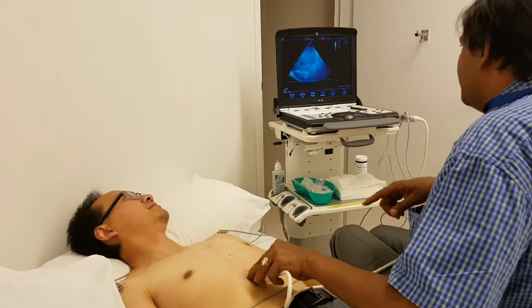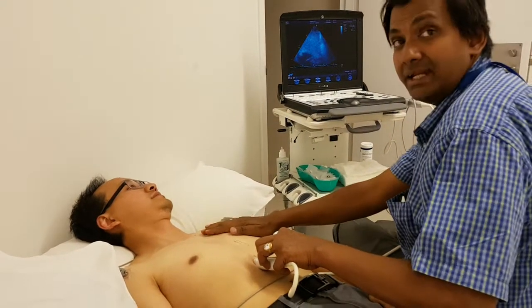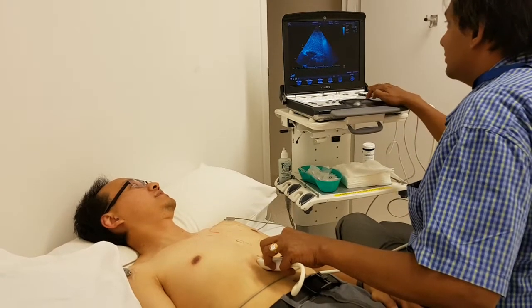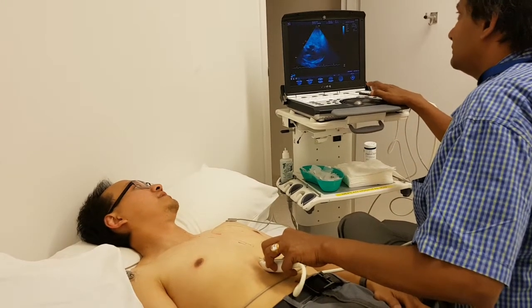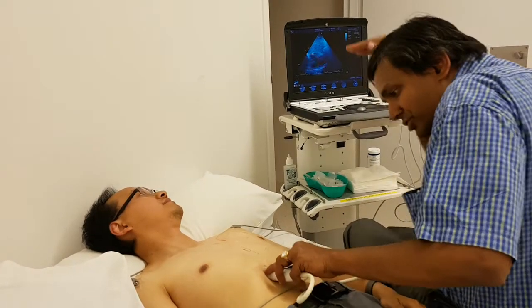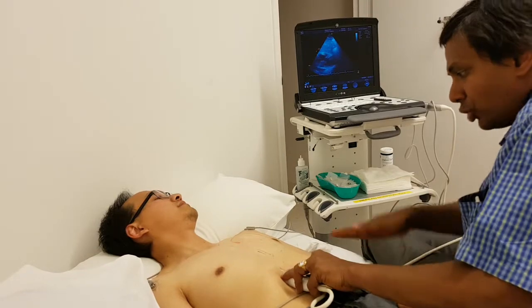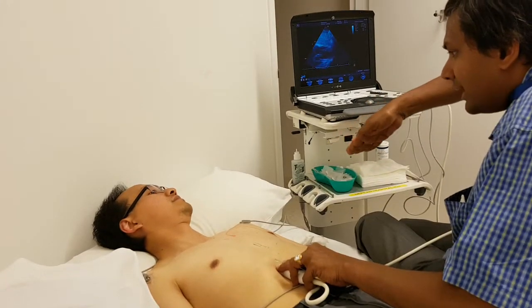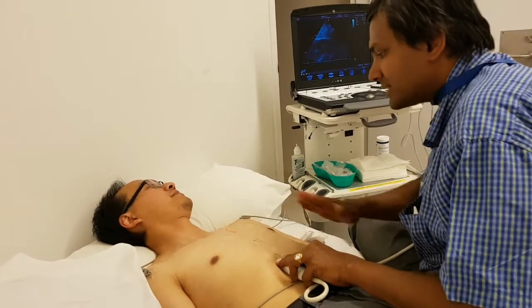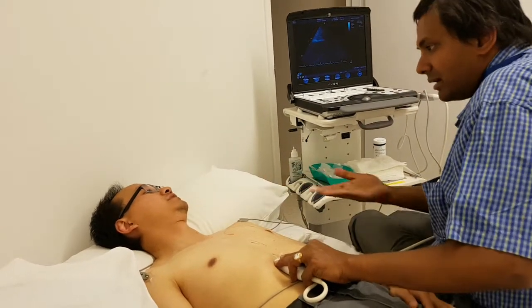The heart should start appearing as I'm tilting. Now see how deep it is, because the heart is very deep from the subcostal plane — it's already 15 centimetres and you can't see. So let me increase the depth. As you tilt, you actually have to push the probe in to get more of the heart, and you also have to go under the sternum and skim the undersurface of the sternum — you want the ultrasound beam to go just deep to the sternum.